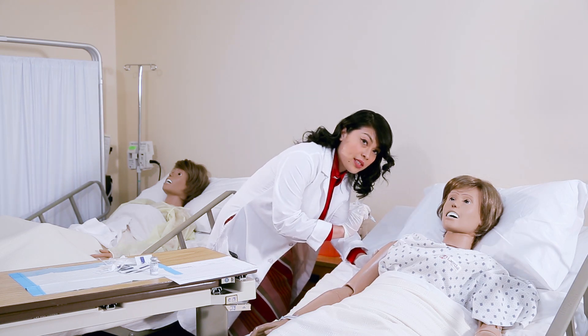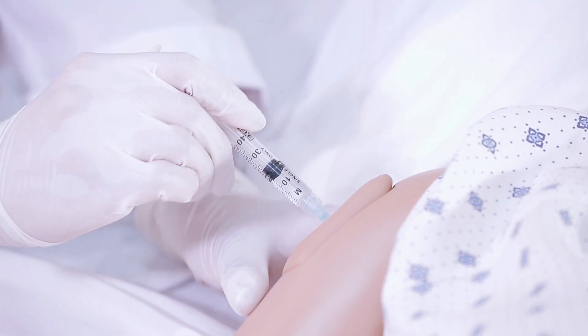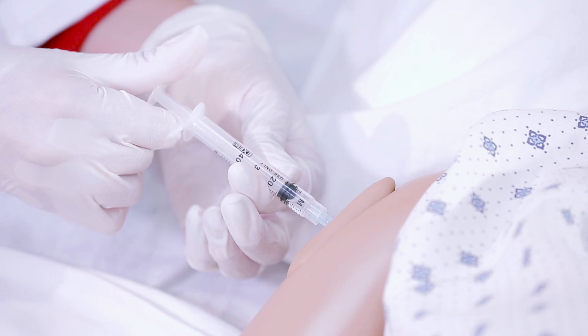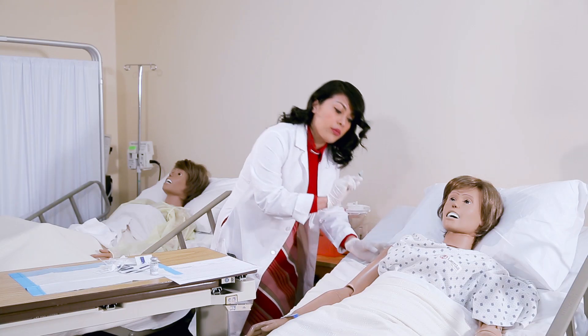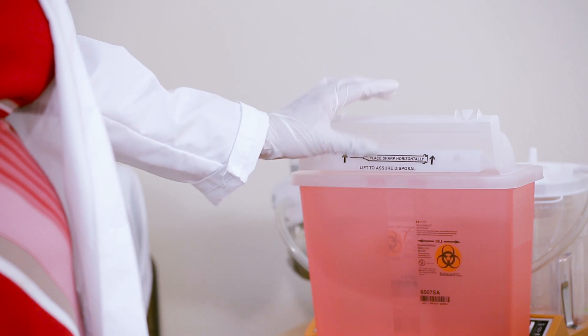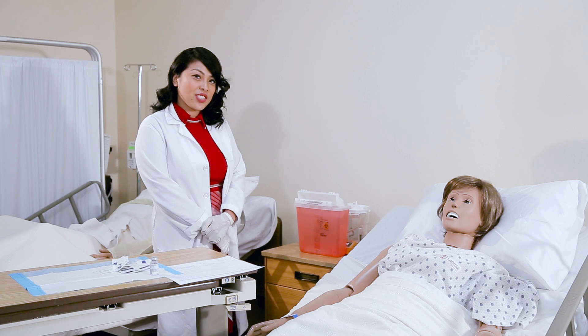You have to make sure that it's at a 90 degree angle — like so, this is 90 degrees — and you insert. Make sure that you take the other hand and aspirate to make sure that there's no blood. Remove and insert it in the proper sharps container. And that's how you properly insert an IM injection.